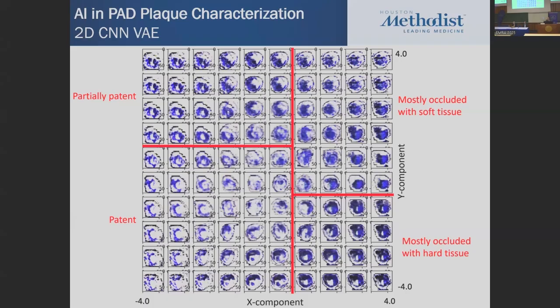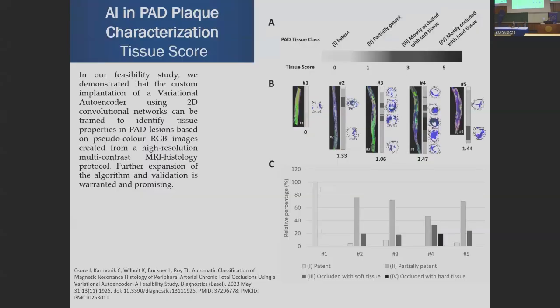So in other words, you feed a slice, an image, to that algorithm, and back comes a number. So you actually translated the complexity, or maybe partially the complexity, of that image appearance into a score, into a number. What you can do then for these 5 samples, shown here on the right in a lateral cross-section, now in full color again, is appreciate the complexity. Maybe not the first lesion, which looks overly patent, but you can look at number 4, very complex. And then each of those slices is assigned a score, and that's shown below.